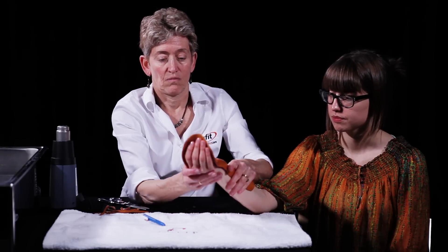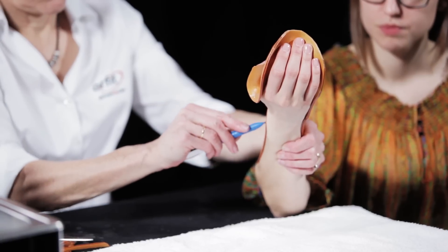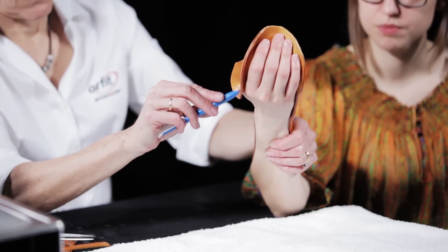Check the fit of the orthosis on the patient and note for correct positioning of the wrist and fingers. Mark the placement of the Velcro loop straps.